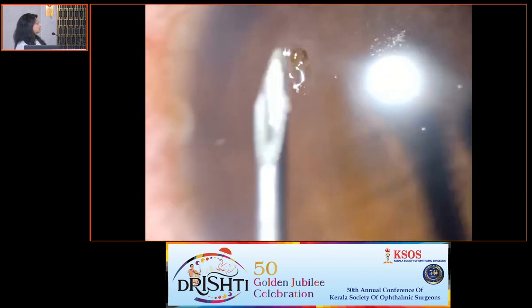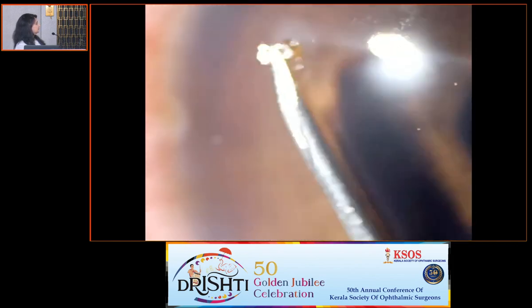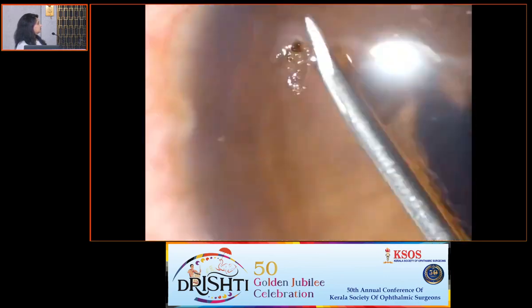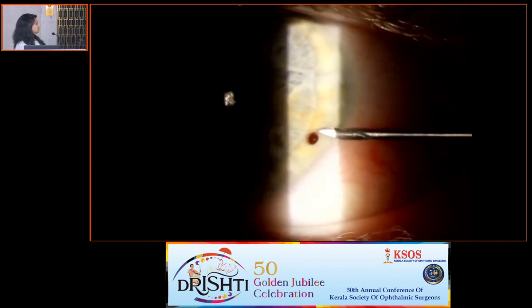Once the foreign body is removed, it's always very important to note the presence or absence of a rust ring. A rust ring can sometimes be very superficial and very smooth, so it may be difficult to remove in the first sitting. In case the rust ring is not removed in the primary sitting, the patient has to be called back after 24 hours. Then it becomes easier to remove the rust ring.